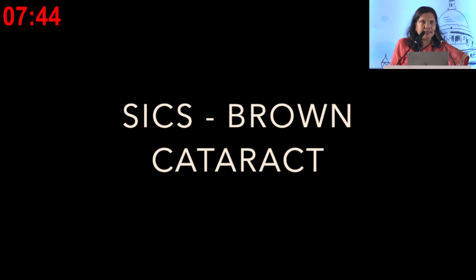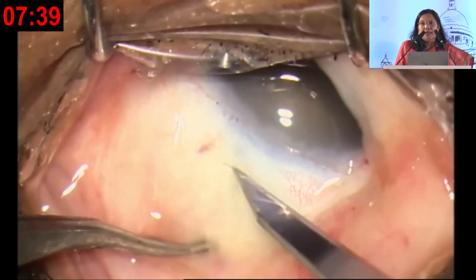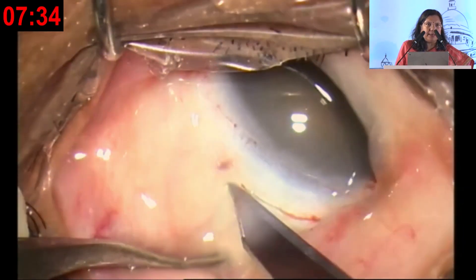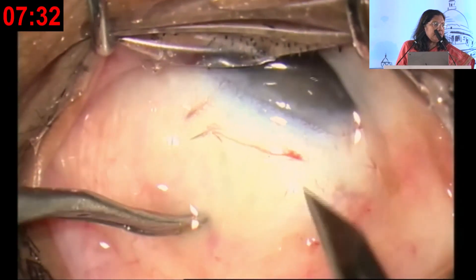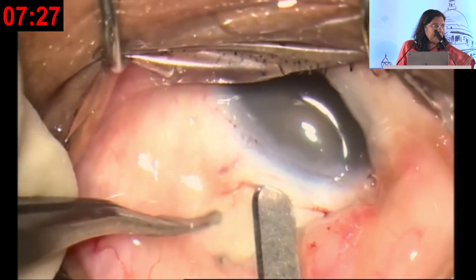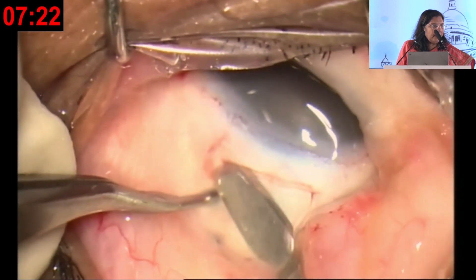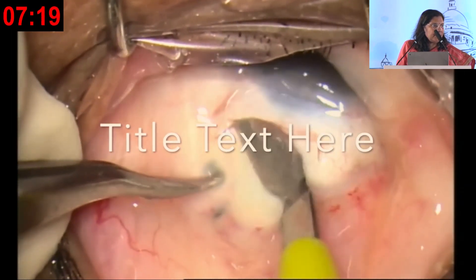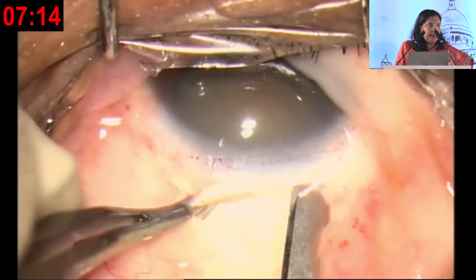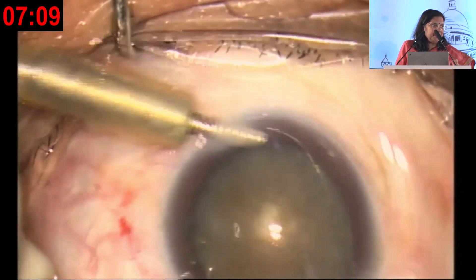This is brown cataract SICS. I get very scared to do brown cataract phacoemulsification because the nuclei are very thick and the sharp pieces of the nuclei can cause a PC tear. It is very comfortable to do SICS in these patients. Making the tunnel is a very important part — dissecting the tunnel and going in. The pockets being formed are extremely important, as they allow you to keep the external incision smaller while making the internal incision bigger.